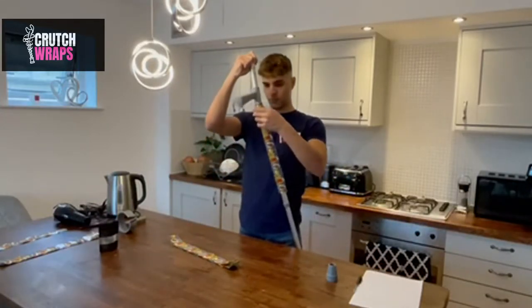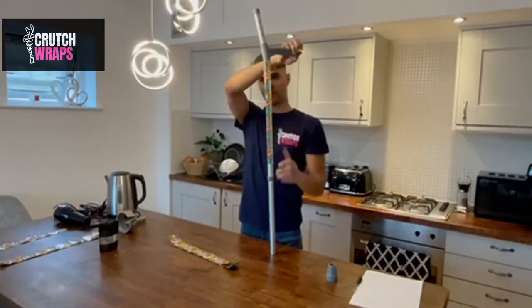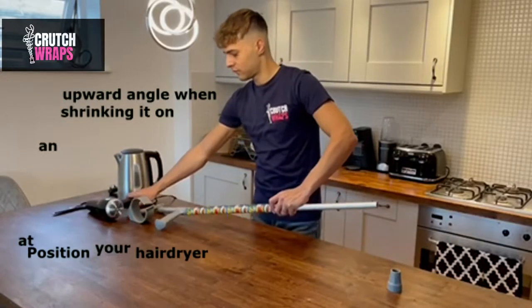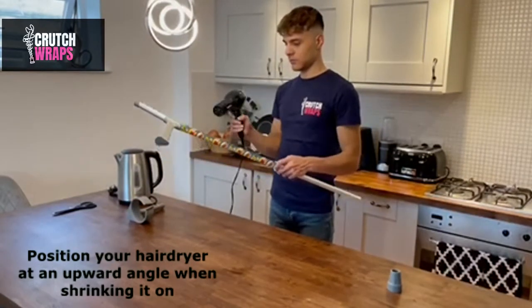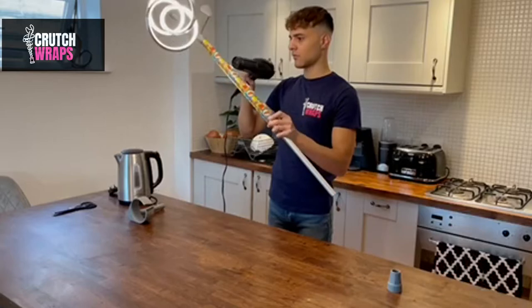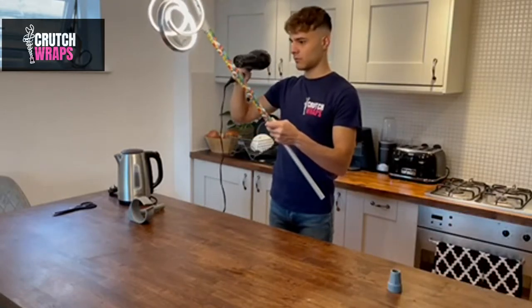Step 4. Use your hair dryer to apply heat onto the wrap to secure it onto the crutch until the wrap is on securely. Do not worry about any bumps and bubbles as the last stage will fix it, and don't hold the hair dryer on the same spot for too long. Be sure to angle the hair dryer slightly upwards to get the best result.